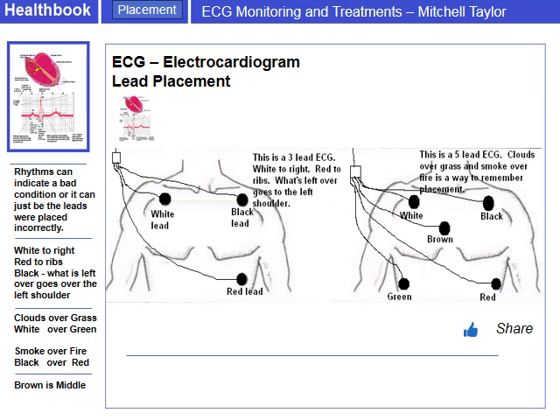Most of the electrodes are labeled. We'll say LL for left limb lead, or lower leg lead, or RL for right limb lead. So you would know where to place them because of that, but this is a saying that helps you do that quicker and know where to place them in an emergency situation.